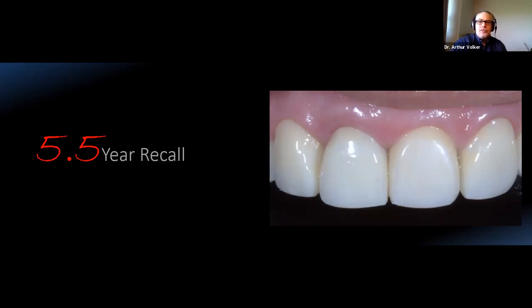And this case is even older now, and she's still doing well with it. But a lab technician told me, likely what your laboratory did is, and I talked about the steps of fixing or treating glass ceramics, they probably pressed it. And remember, when things get pressed or milled, they come not only monolithic, but monochromatic. So the next step you would typically want to do is place a stain, and then heat it so that the stain takes, and then put on a glaze. Well, for those of you who want to do this at home, just take care, because there's also the option to do a stain and glaze in a single step. And so what likely happened here is that the laboratory did a stain and glaze together, and over time, when the glaze starts to wear, you also lose the stain, and you create a monochromatic or splotchy looking restoration like here.